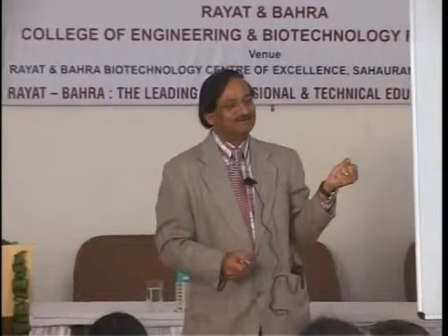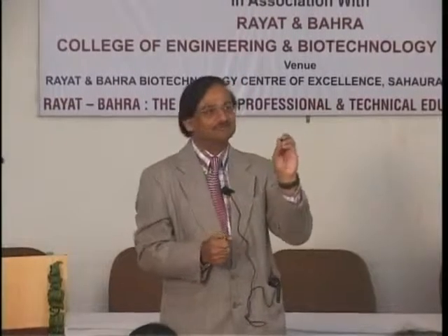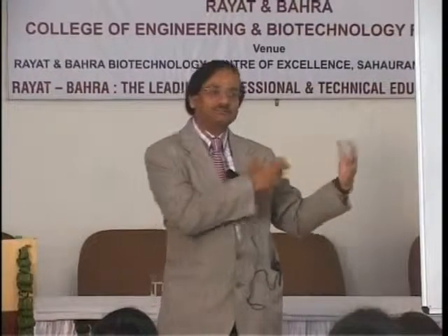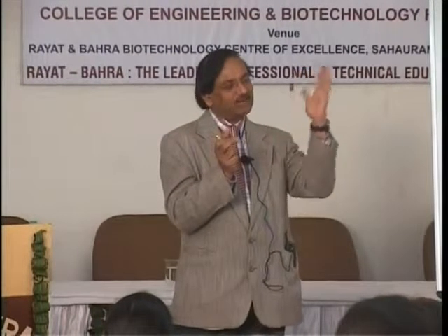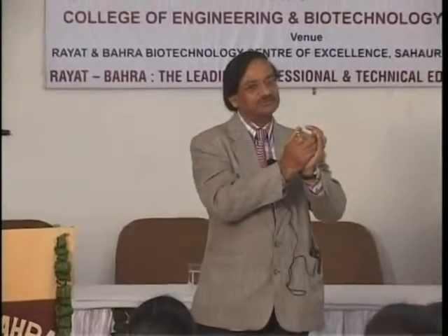You have software. You have two images. The software will fuse these two by coupling, and you can show in space where that lesion is. But when a structure is moving in the body, like your heart is moving, or you are taking respiration, you cannot do this, because at one phase you are taking one image and at another phase you are taking another image. So if you try to do a software fusion, the images will be misregistered.